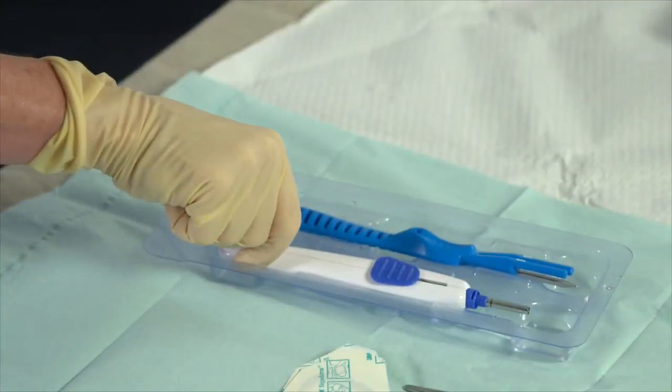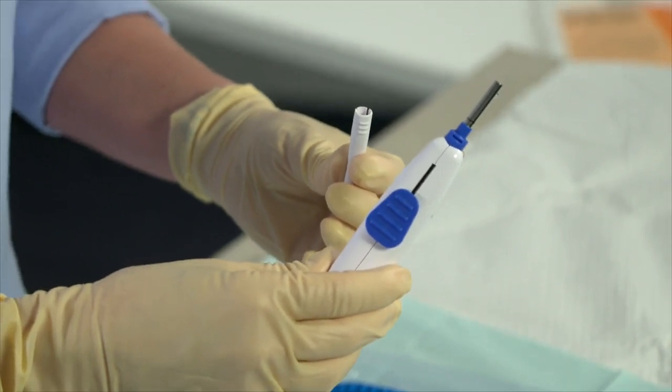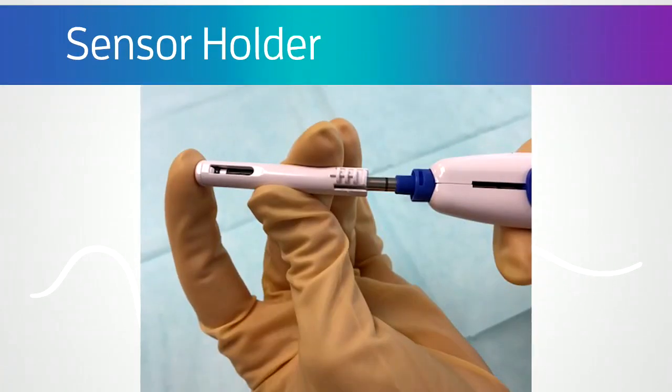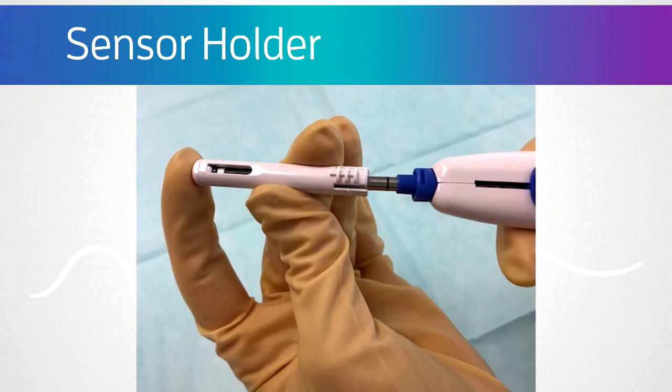Next, pick up the insertion tool from the tray. Ensure the blue slide on the insertion tool is in the retracted position. Align the slot of the sensor holder with the slot in front of the slide. Support the tip of the sensor holder as you slide it over the insertion tool's metal cannula until it clicks.